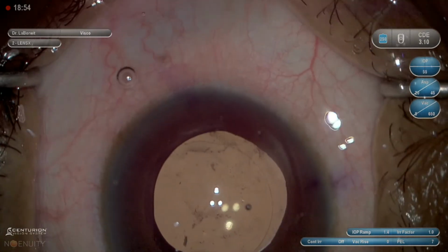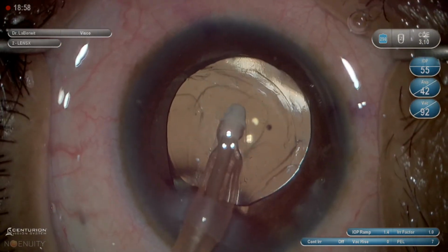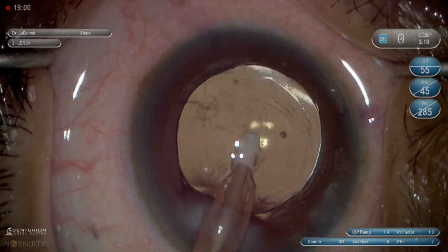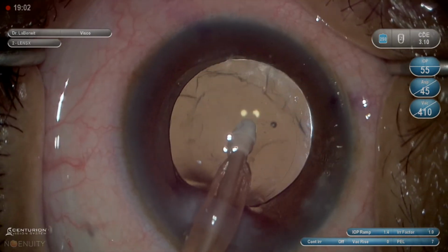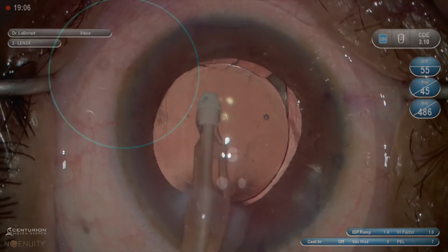or the IOL haptics stretch out inside the capsular bag. I also have a presbyopic correcting lens, so I want to assure great centration long term as well for the focusing piece. This is a zoomed in area showing it is now continuous after the technique was used.